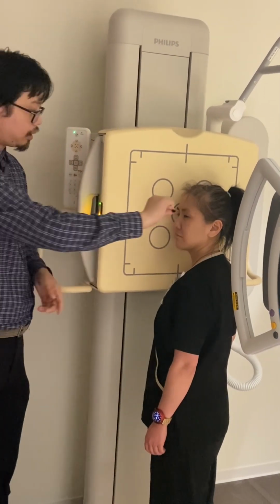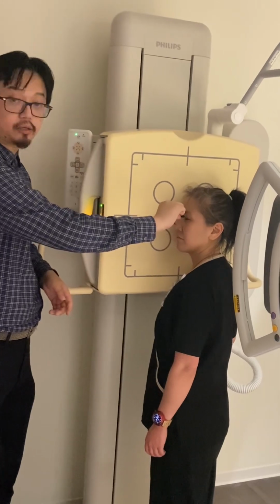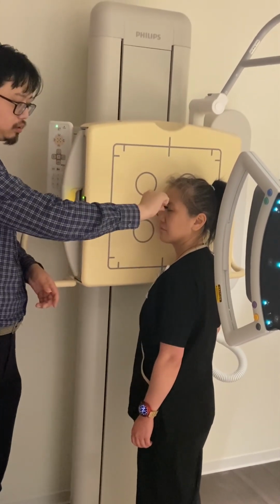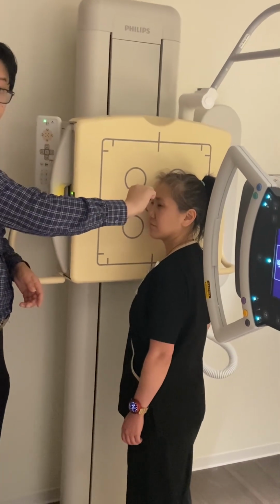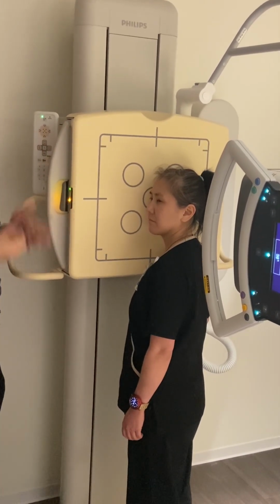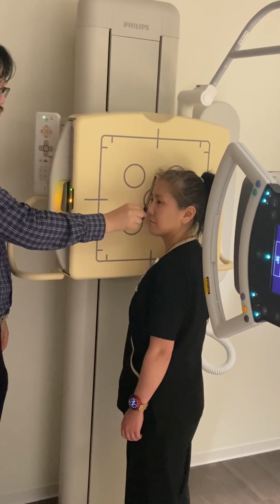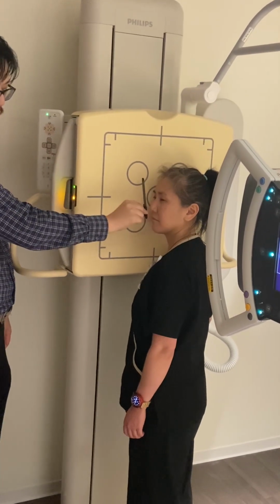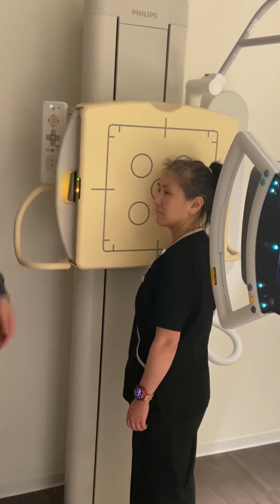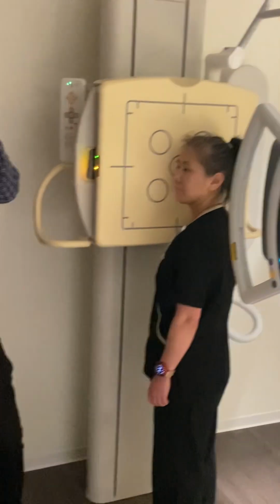Number two, IPL needs to be perpendicular to the IR. If it's not perpendicular, that means it's either tilted, right, or rotated. Okay? And then third, for me, MSP, make sure the MSP is straight and not tilting. Okay? So those are the three things that I recommend looking for here.